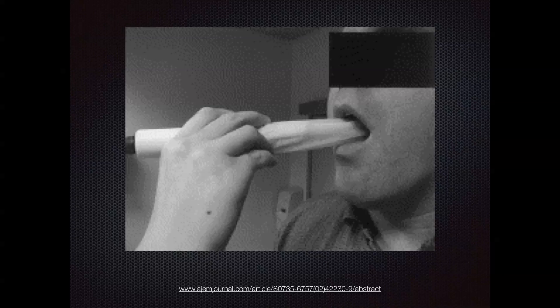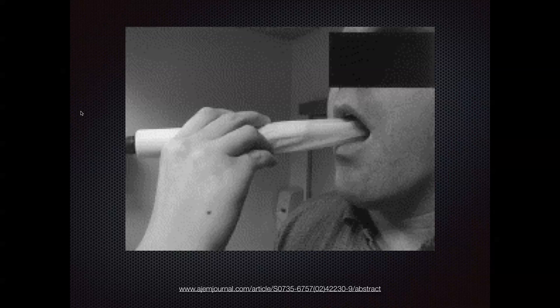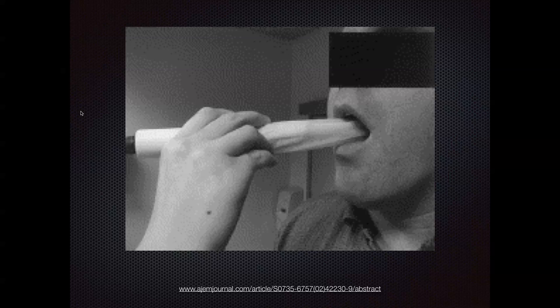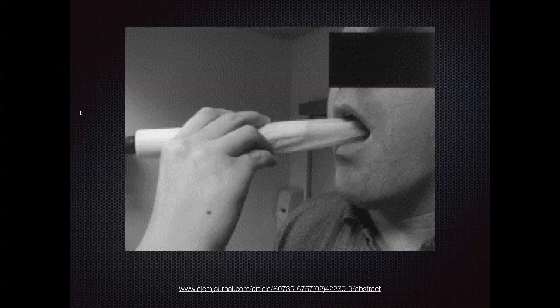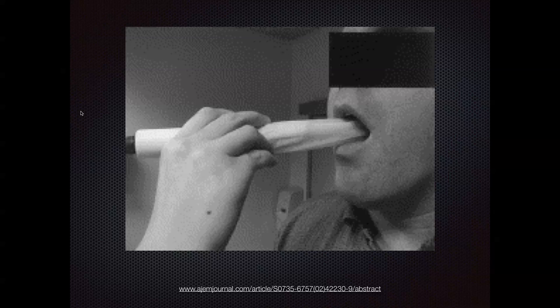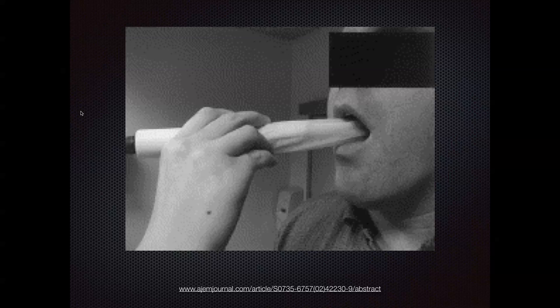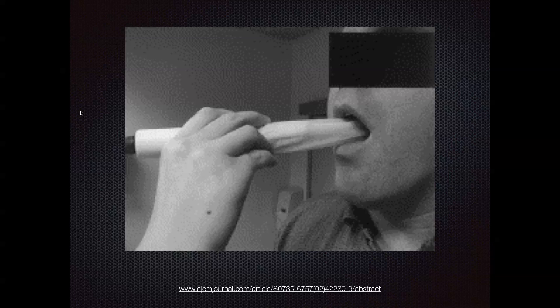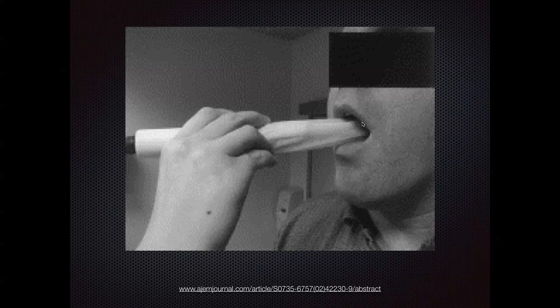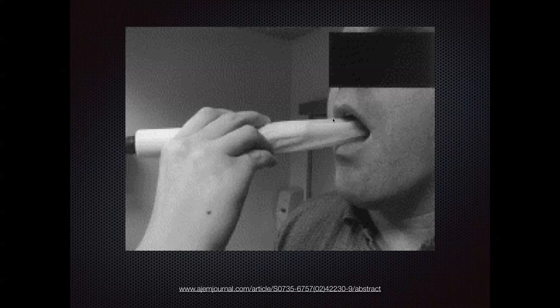That is a technique that is commonly used. I personally have had some problems with that. Once you identify it using the endocavitary probe, you have to remove it and then follow it up with a blind poke. The two big challenges are mostly that you see these patients with trismus that can barely open their mouths. You're putting this gigantic probe in the mouth and you're using up most of that real estate of the mouth.